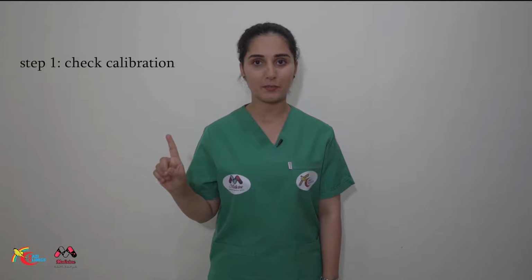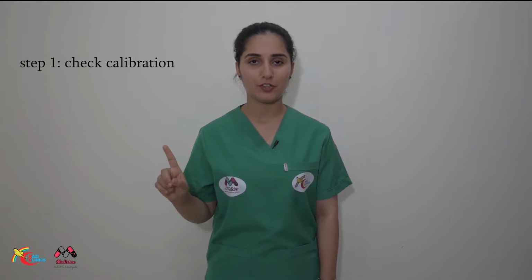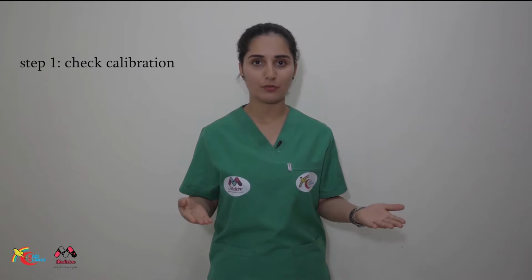In ECG interpretation, it is better to have a systematic approach so that you will not miss your findings. The first step is checking the calibration, which is the speed and the amplitude. The speed is the speed at which the ECG is recording those electrical activities.